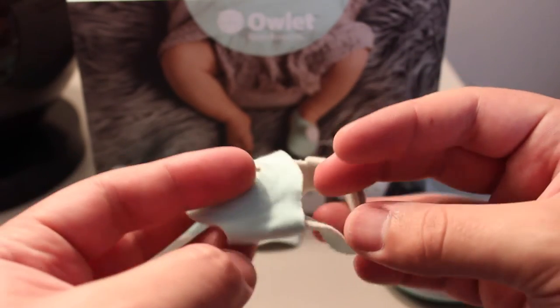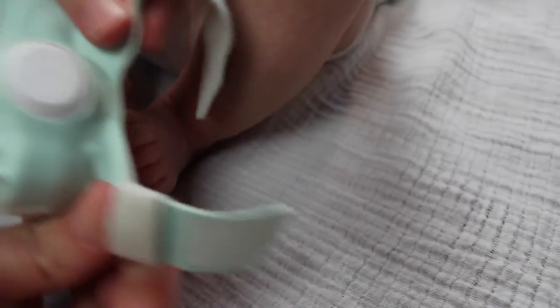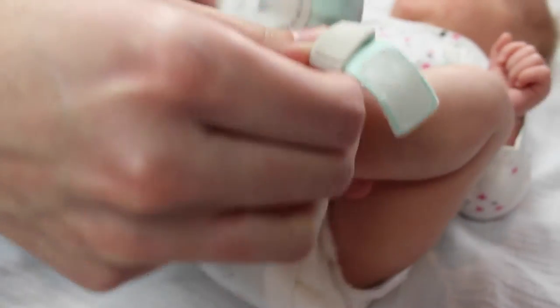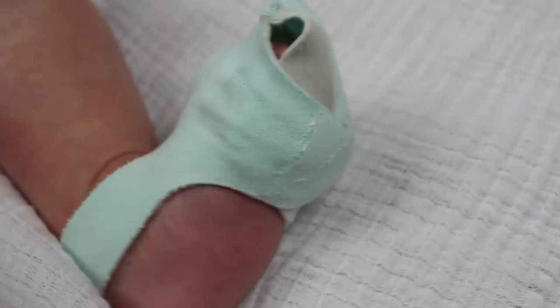Owlet did a really good job when it comes to the fabric — it's super soft and super comfortable. My only complaint is that the design of the sock is a little bit complicated. It definitely takes some practice getting this sock onto your baby, especially when your baby is kicking his or her legs all over the place and you're trying to get the sensor onto their foot for an accurate reading. To Owlet's credit, they did recently release a brand new sock design, and from what I've seen online, it looks much better — though it's still not quite where I'd like it to be. I'd honestly love to see something where it's literally just a sock you can slide right on with no straps or anything.